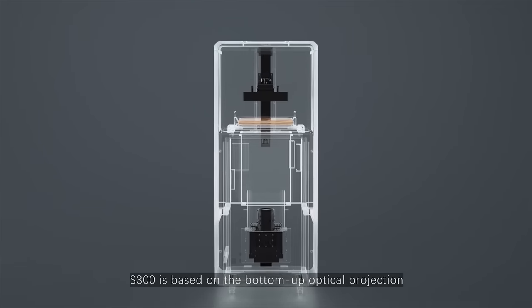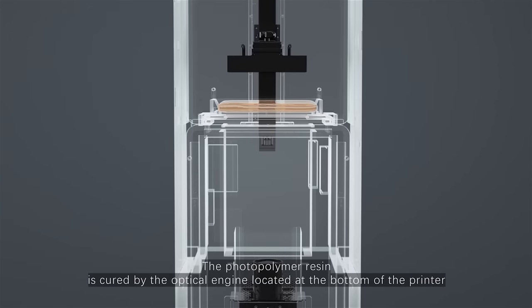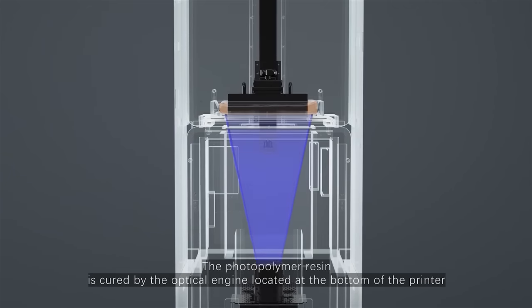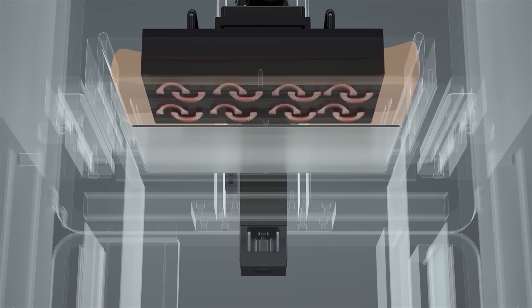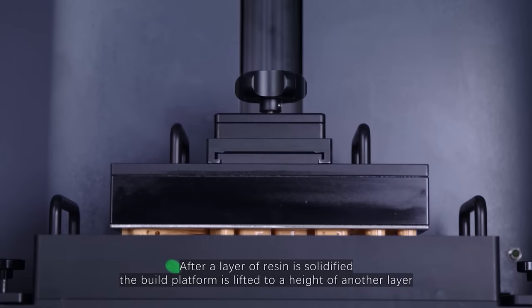S300 is based on the bottom-up optical projection. The photopolymer resin is cured by the optical engine located at the bottom of the printer. After a layer of resin is solidified, the build platform is lifted to a height of another layer.